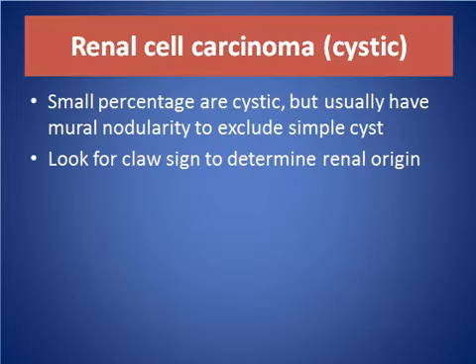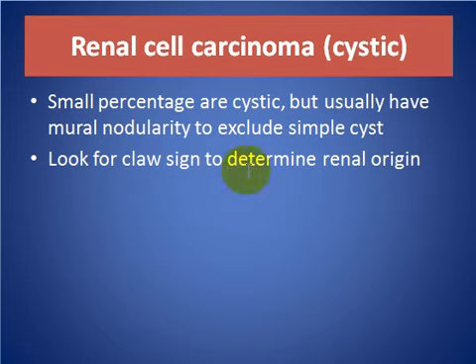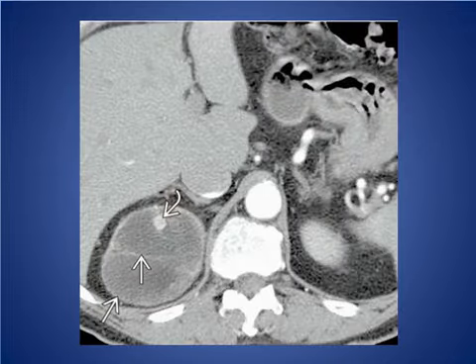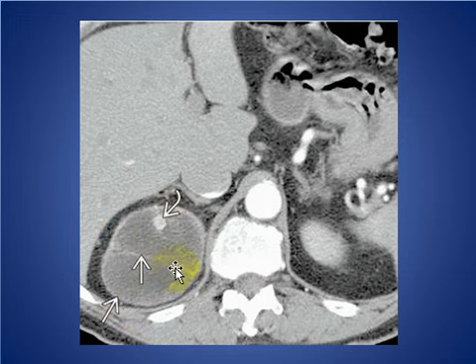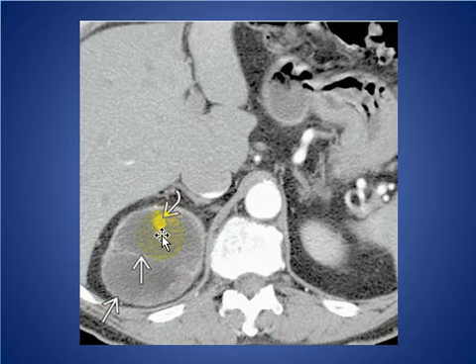Renal cystic tumor: it is a small percentage of cystic masses but usually has a mural nodule, which will exclude simple renal cysts. We should look for the claw sign to determine renal origin. Here we see a cystic mass lesion in the right kidney arising from the superior pole, with thick enhancing wall, enhancing septation, and a mural nodule — consistent with renal cystic carcinoma.